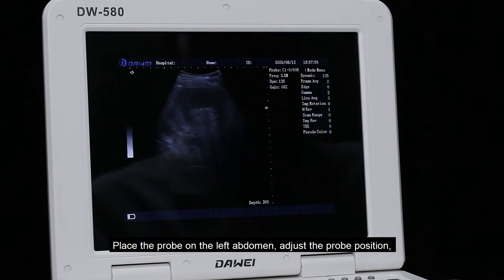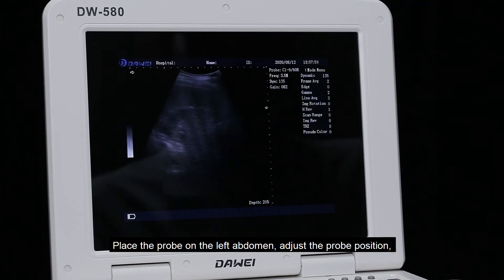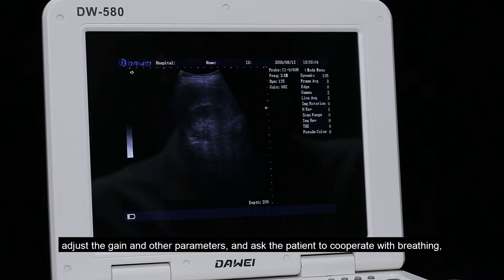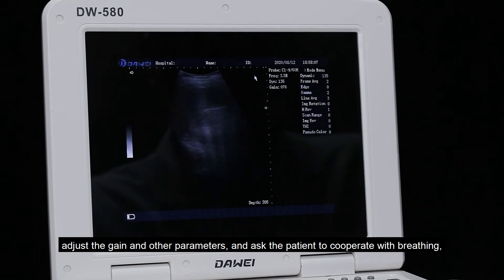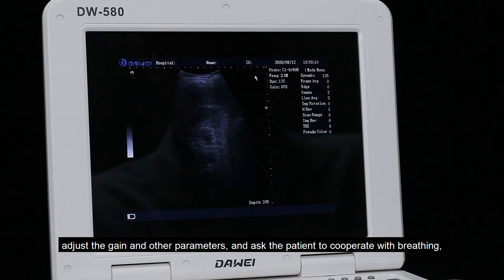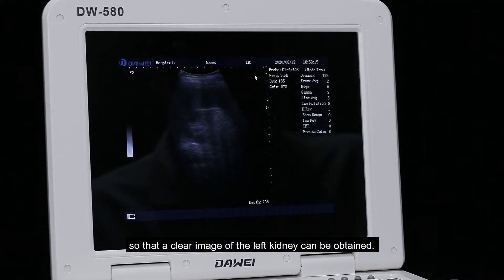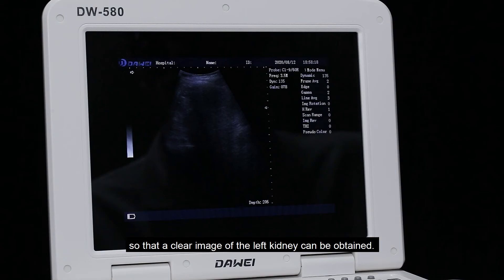Place the probe on the left abdomen and adjust the probe position. Adjust the gain and other parameters, and ask the patient to cooperate with breathing so that a clear image of the left kidney can be obtained.